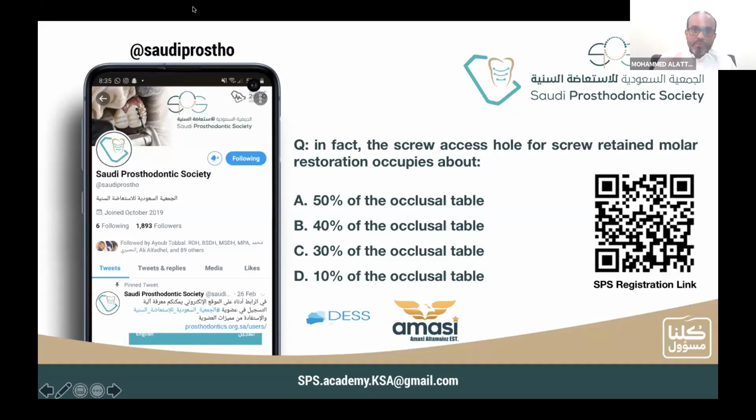Is the occlusal night guard recommended for overdenture cases? As I said, for a patient with a bar or any attachment, because sometimes the patient has an opposing bar, at night he may oppose metal to metal. For that reason, I recommend a flat appliance for metal substructures too. The flat appliance is not only for teeth or porcelain prostheses, but also for metal substructures placed in the patient's mouth; you also need to make a night guard or flat appliance.